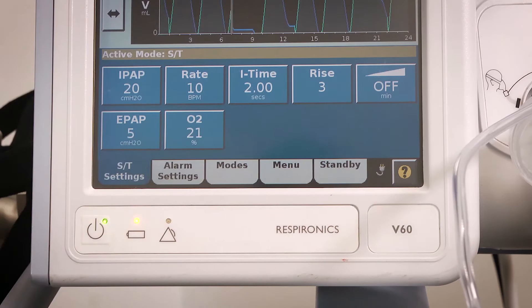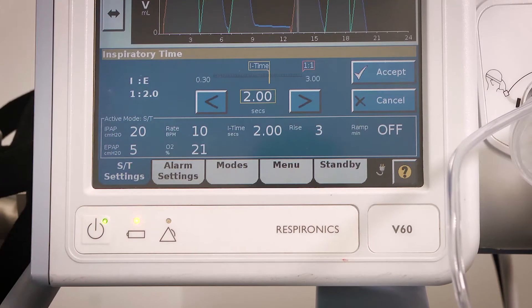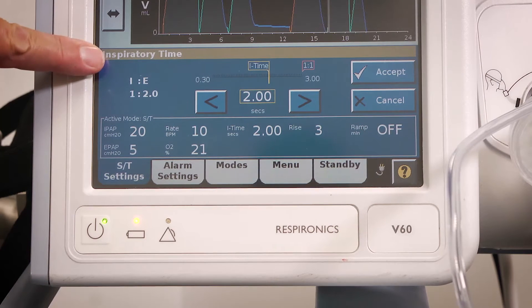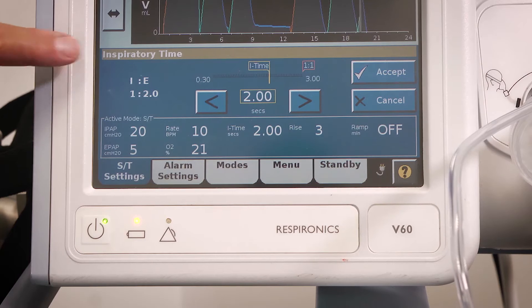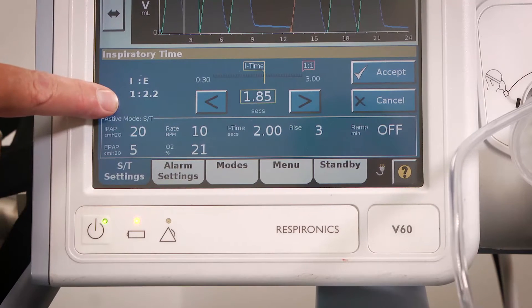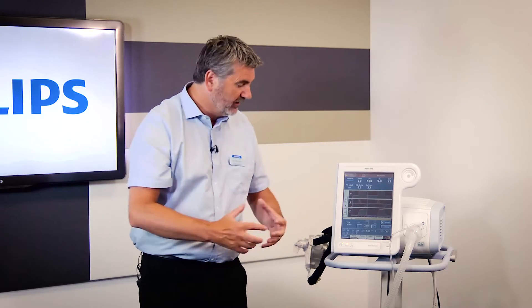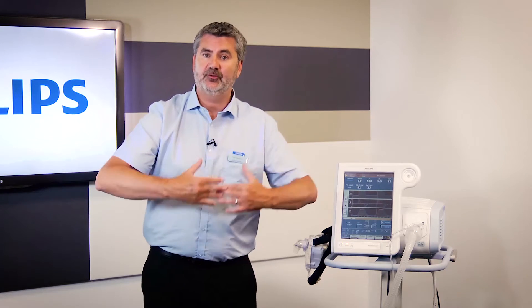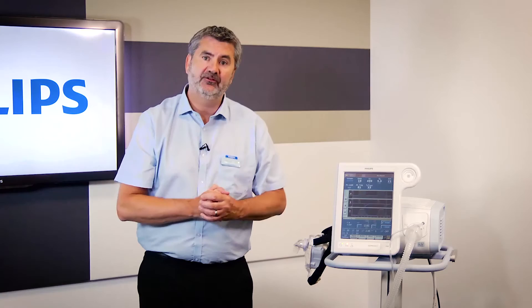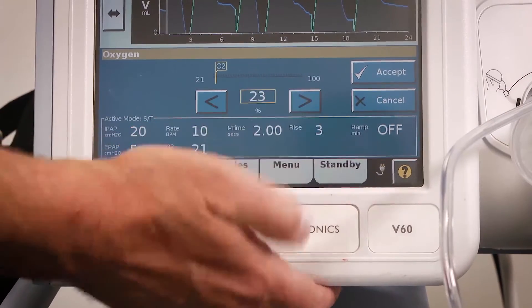The machine then needs to know how to deliver that backup breath, so we need to set the inspiratory time — the I-time. This is only used for the backup breath in spontaneous timed mode, not for spontaneous breaths. I've set this to 2 seconds. The screen shows how this affects the inspiration-to-expiration ratio. With 2 seconds of inspiration, the patient breathes out for 4 seconds — giving a normalized 1:2 ratio. Accept that.